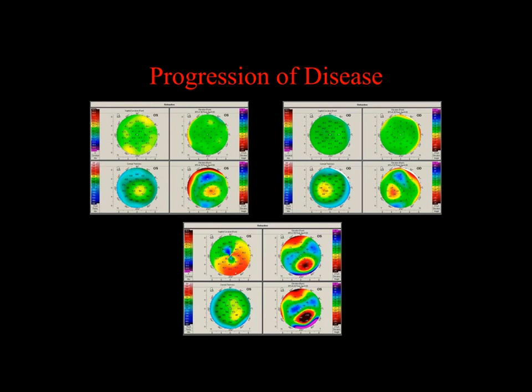So it's not a normal cornea, but it's a patient with normal vision. Now, granted, if you tested them on very sensitive contrast sensitivity, I'm sure they have some aberrations. But in general, this is an asymptomatic individual with an ectatic cornea limited to the posterior surface.